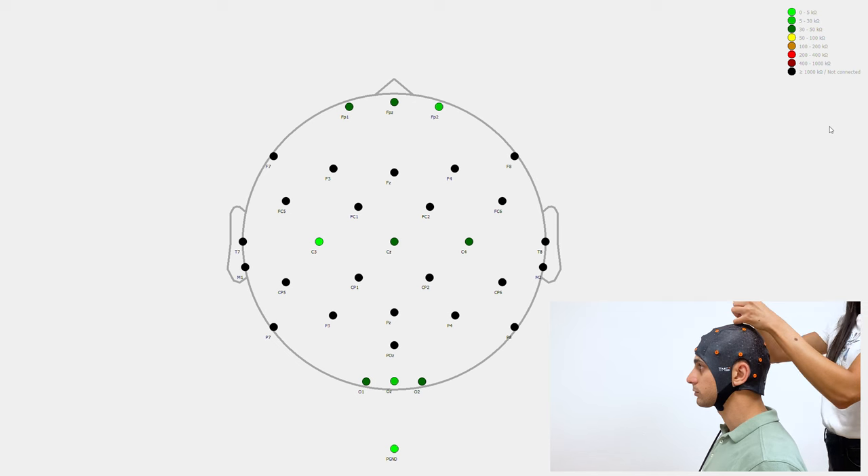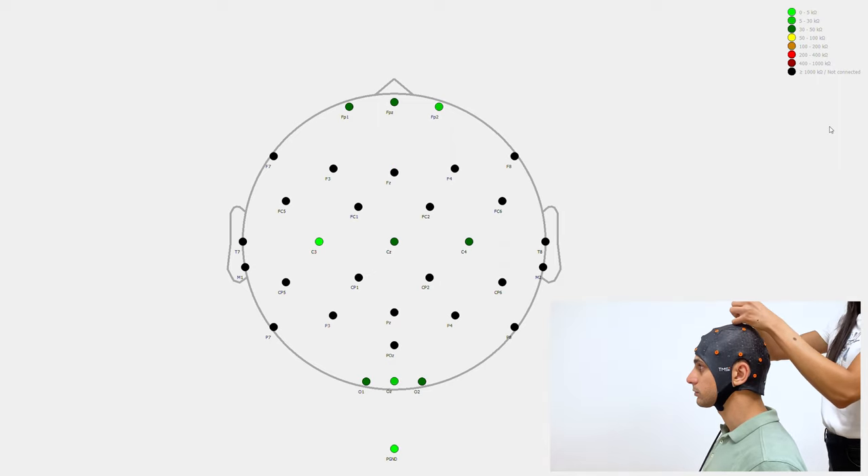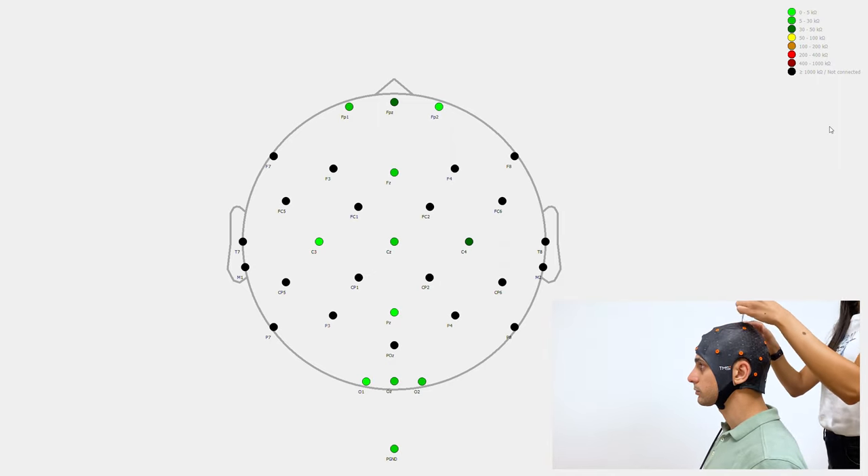Monitor the impedances on the screen of your PC while you rotate the syringe to know when you have a good electrode-skin connection. Once you apply gel to all the electrodes you would like to measure and have checked the impedances, you are ready to start your measurement.